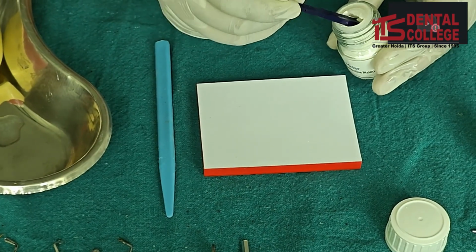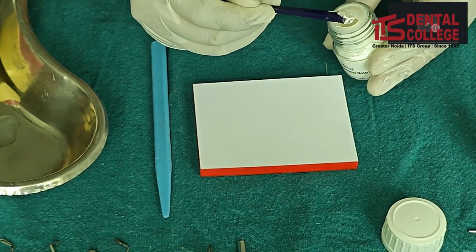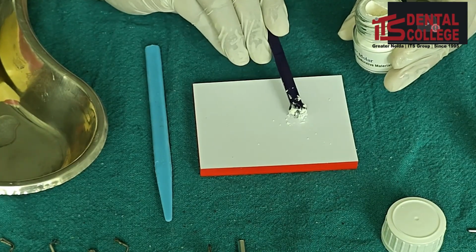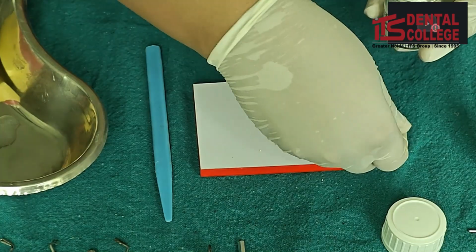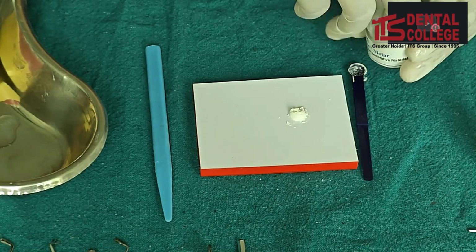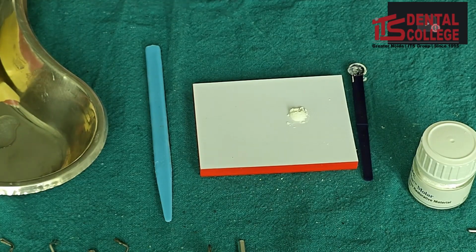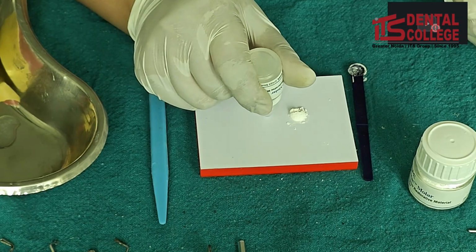I will level the scoop with the plastic insert provided on the inner side of the bottle. That is 3 times the quantity of powder to 1 drop of liquid.